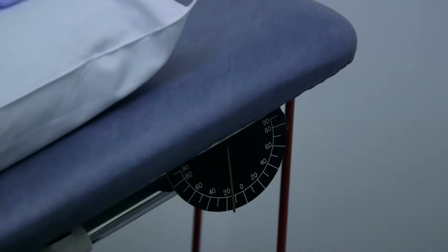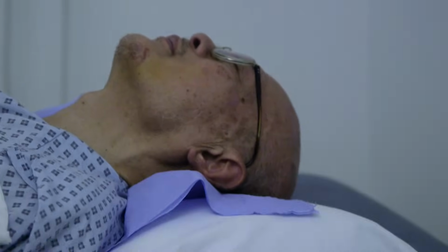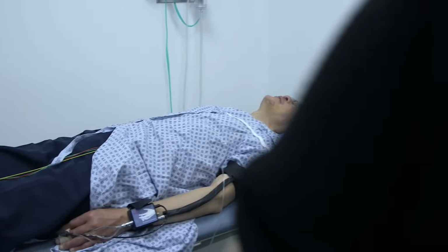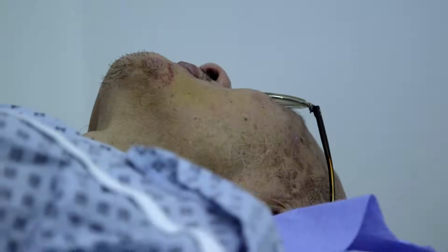After the spray, it's another 15 minutes, and then that's the end of the test, and we'd lie them flat. If the patient has had a positive tilt test, they may feel a little bit groggy or unwell after the test. You okay? Yes. We usually give them a few minutes to recover, make sure they're feeling better, and then we'll go through the results with them. We usually suggest that it's a good idea to bring someone with you when you have a tilt test. So if you do feel a bit unwell, you've got someone to take you home and look after you.